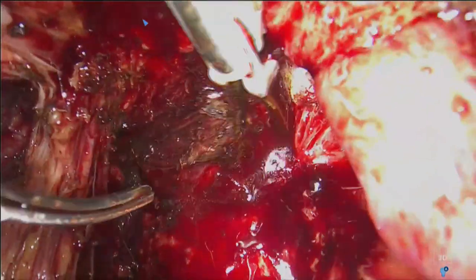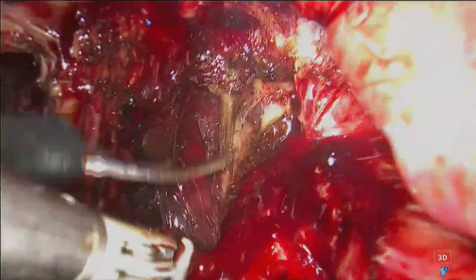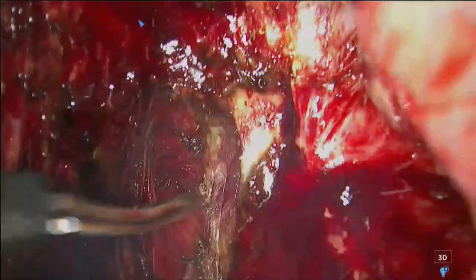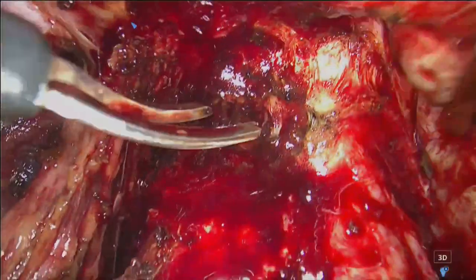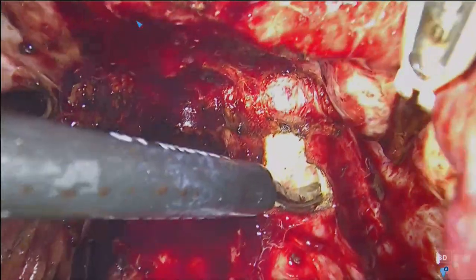We are going from the lateral part to middle, and we are inside the rectovaginal septum now. I can work now with monopolar too, pushing the rectum down and going under vision in the very good right plane here. Then you see the movement from Lucia that push back the uterus, and I'm ready to work here at the level of the insertion of the right uterosacral ligament.